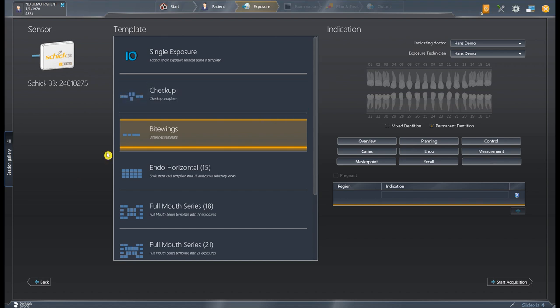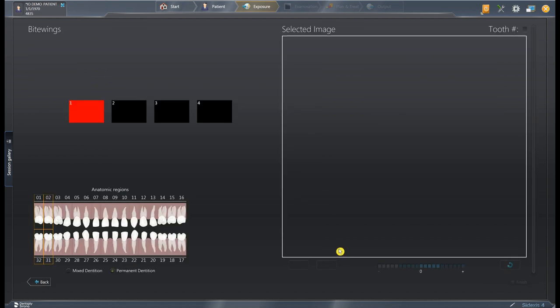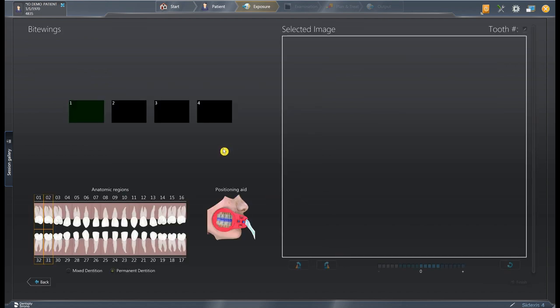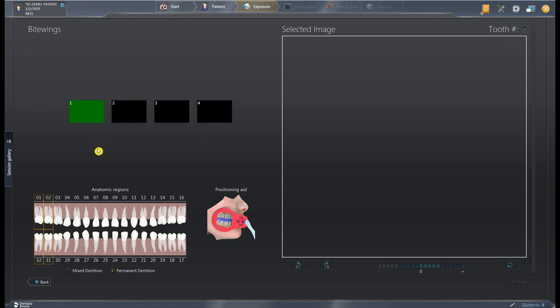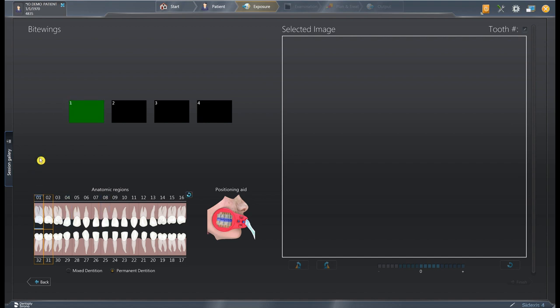Once I have this selected I can go to Start Acquisition and it will take me to our next screen. You'll see positions one, two, three, and four because we're using a four ByteWing template, and the flashing green lets us know that the sensor and software are ready to acquire an image. Down here under anatomic regions you'll see that we have teeth numbers 1, 2, 32, and 31 highlighted because they are pre-selected in our template, which helps us sort and filter when we're on the timeline.